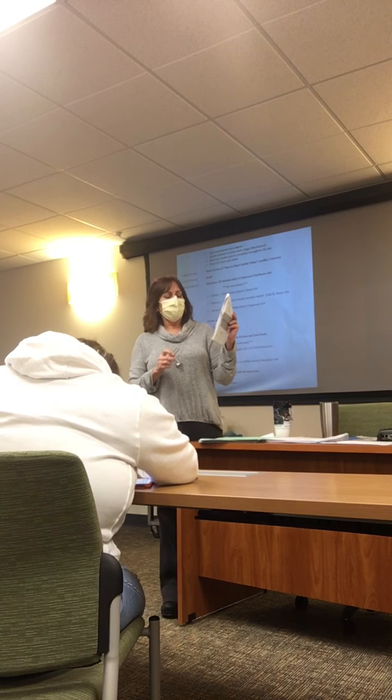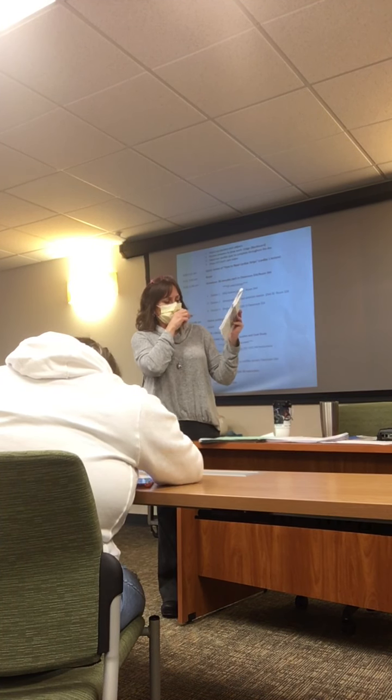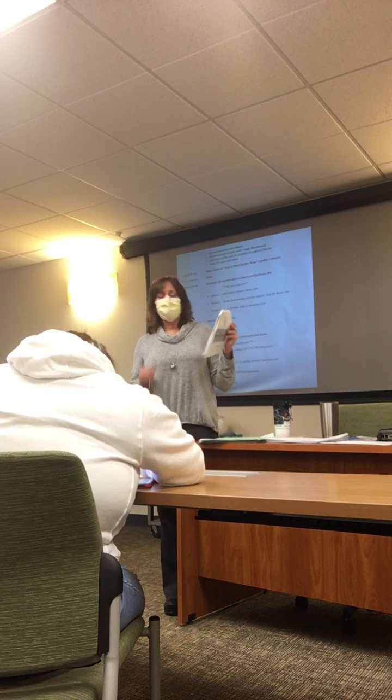0.16. Good. Can I measure the QRS in the ones that look normal, not the different ones? Yeah. How many little boxes are you getting there? 1. So what is my QRS interval? 0.04. Is the rhythm regular?